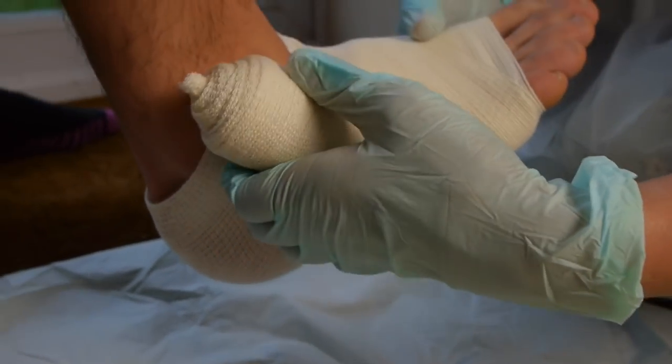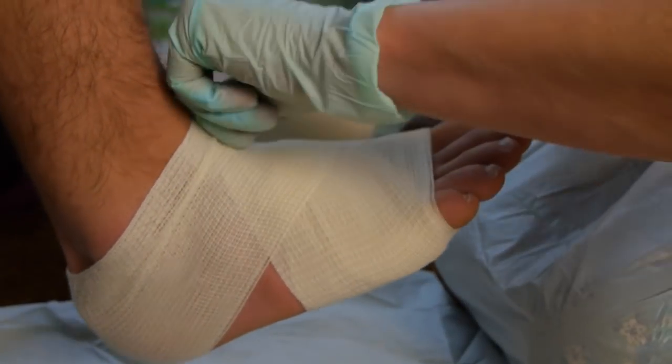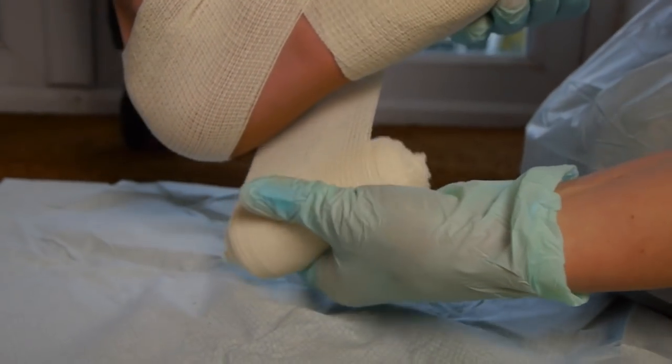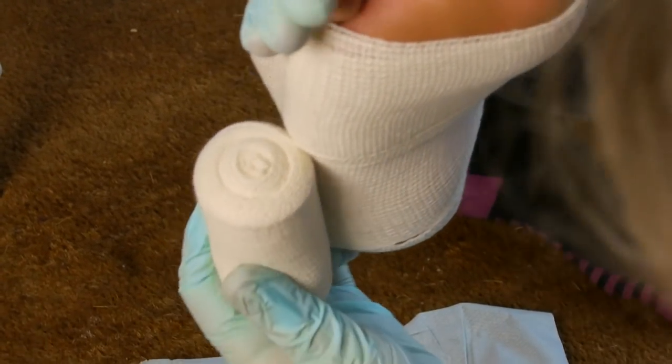Next, bring the bandage back round and again diagonally over the foot. We then want to bring it underneath to cover that hole there so that the whole foot is covered.